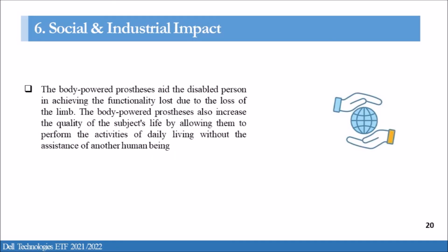According to the World Health Organization report in 2021, there are 30 million people who need prosthetics all over the world, and probably most of them lost their jobs. So our aim is to design a prosthetic limb with relatively low cost that most people can afford, to improve mobility and the ability to manage daily activities, as well as provide the means to stay independent.